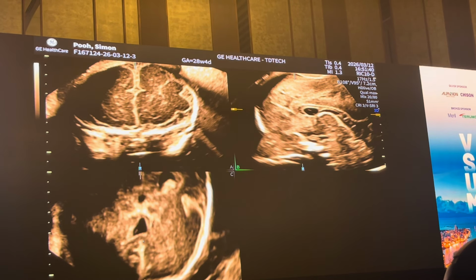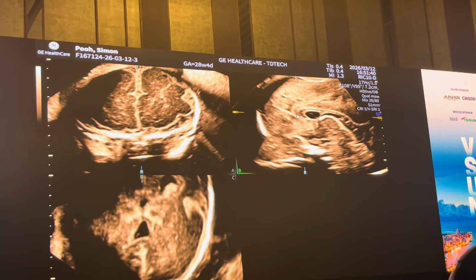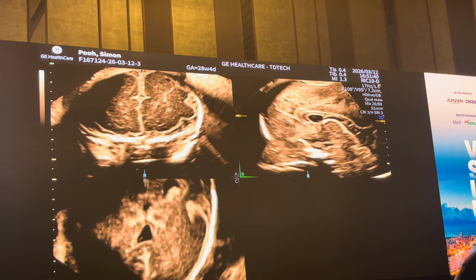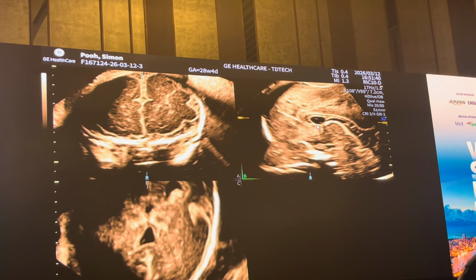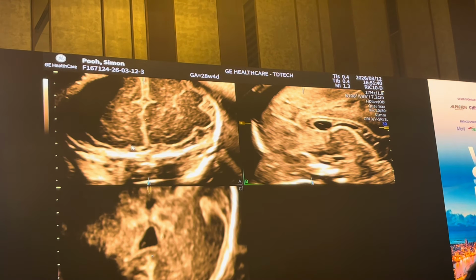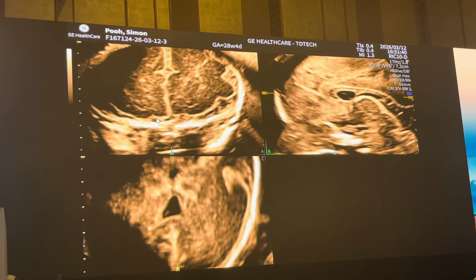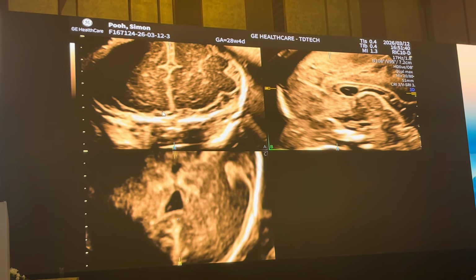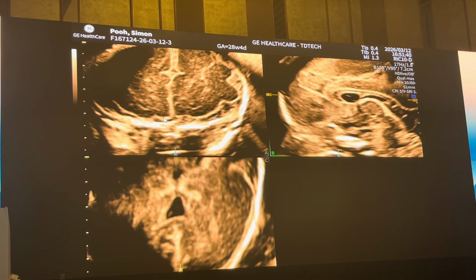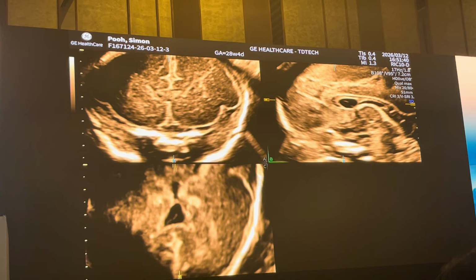Is the dot on the B plane? Yeah, on the B plane. Okay. And then almost between the anterior part of the corpus callosum to here, there is this one. It is very small, but this is called the olfactory sulcus. So when you look at that, Ritsuko, you're using the B plane and putting your reference dot at the level of where the genu joins the body to bring up the olfactory sulcus.